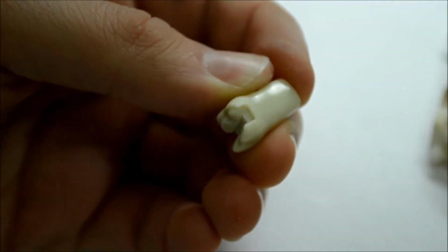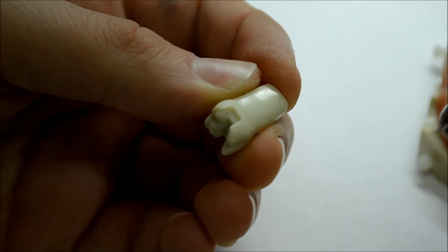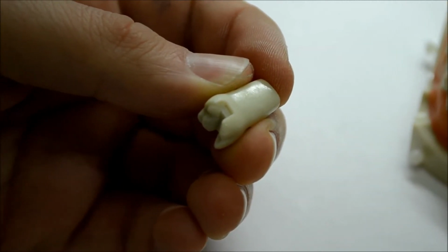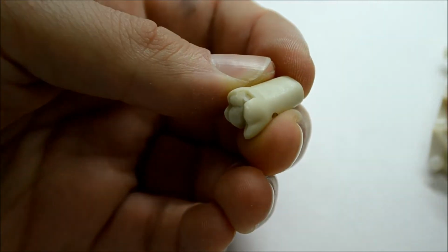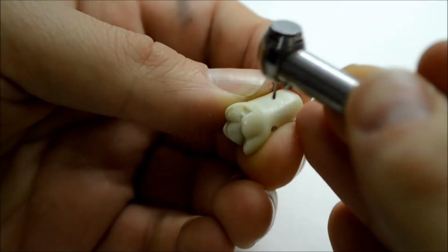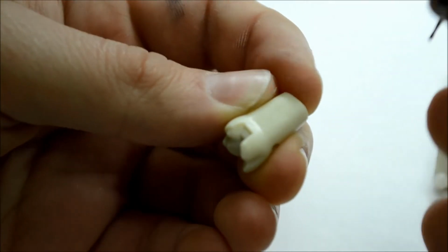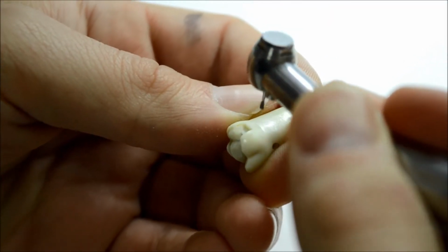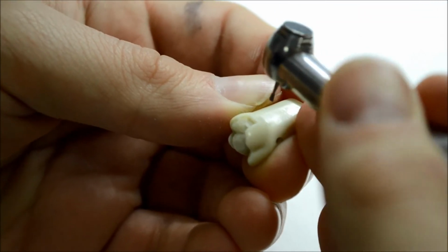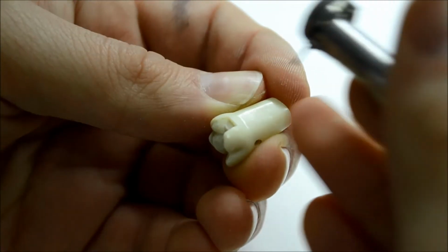One thing that happens a lot initially while drilling is that you're going to burn the plastic tooth. Since there's no water spray, the friction caused by the burr causes the plastic to burn, and it doesn't look good when your prep has a burn mark inside of it. So to prevent that from happening, don't keep the burr at one place for a long time. Go brush against the spot that you're drilling against so that the heat doesn't build up there for a long time.